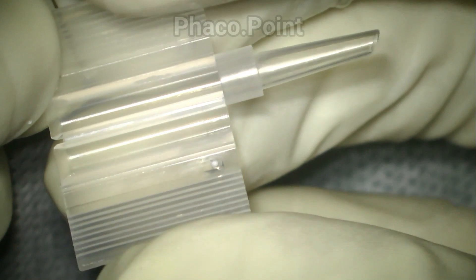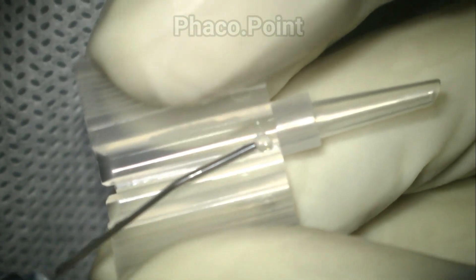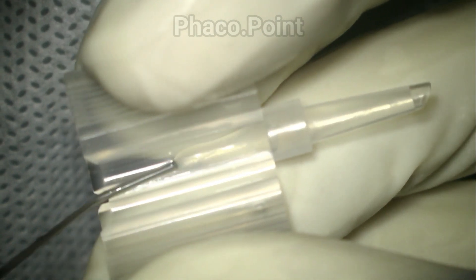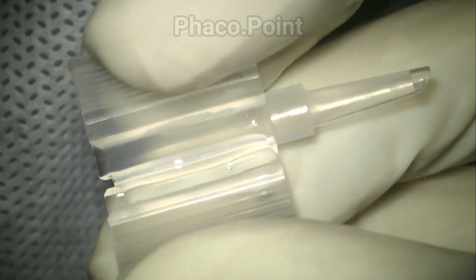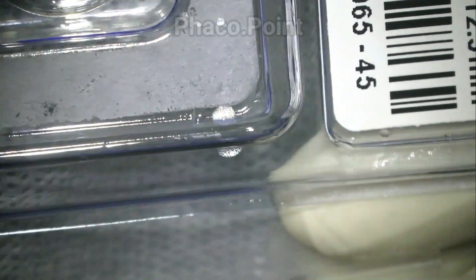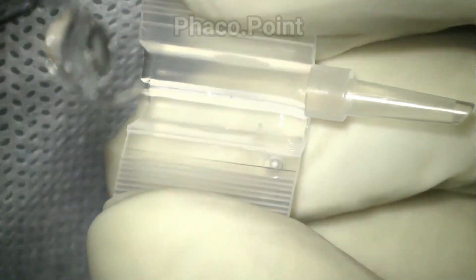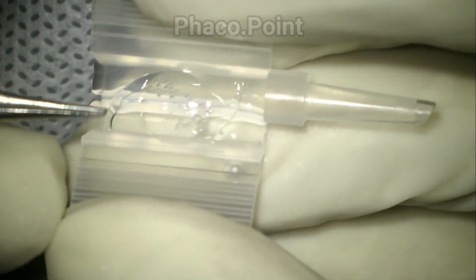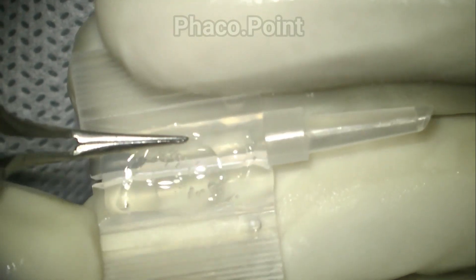The scope is moved away from the patient's eye to facilitate clear visualization. This is the butterfly cartridge, held in the non-dominant hand, while the surgeon insufflates the nozzle and the cartridge with viscoelastic — with extreme care, without damaging the optic. The surgeon carefully picks up the IOL and places it in the cartridge.